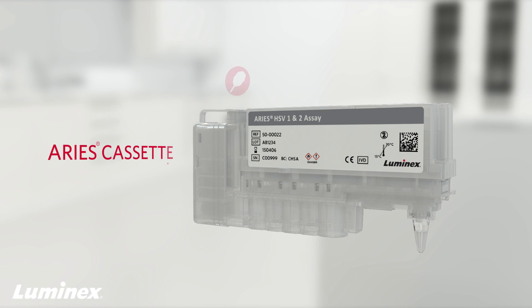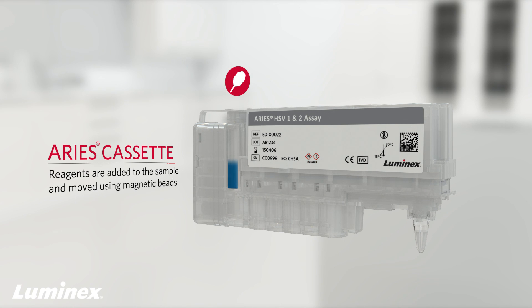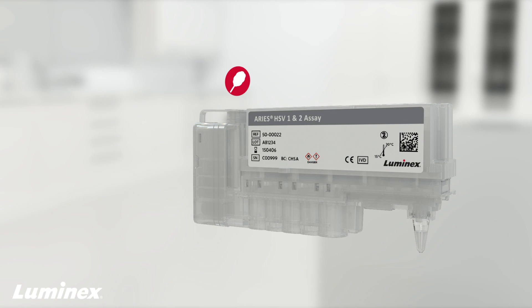During processing, reagents are added to the sample and moved using magnetic beads through a series of washes inside the cassette, preparing it for PCR. PCR amplification and detection takes place in the PCR tube at the opposite end of the cassette, where the PCR reagents and primers are located.